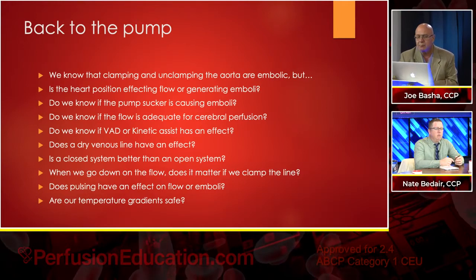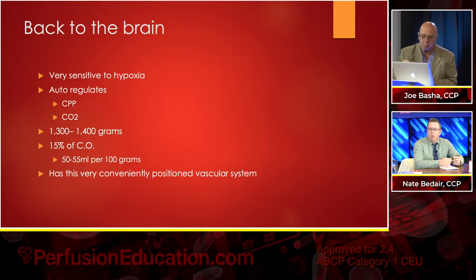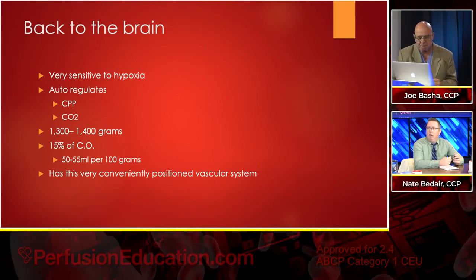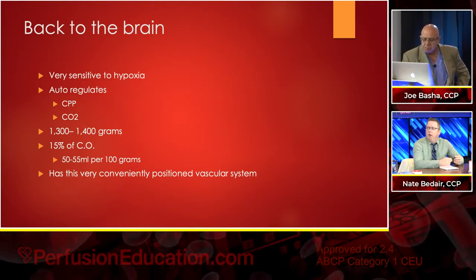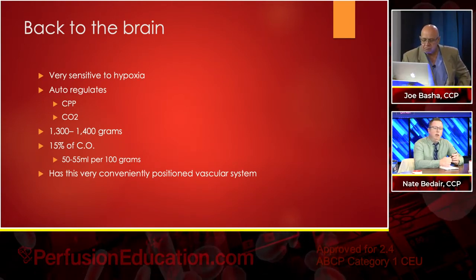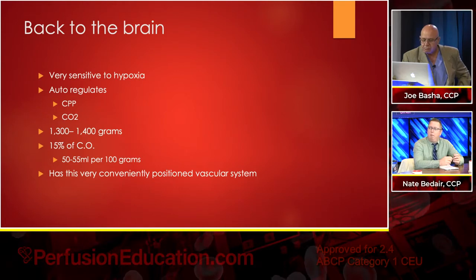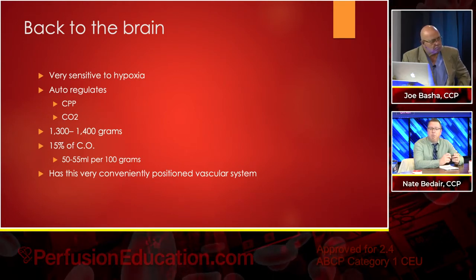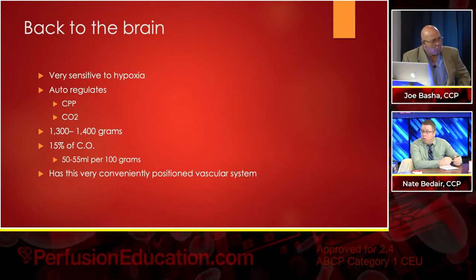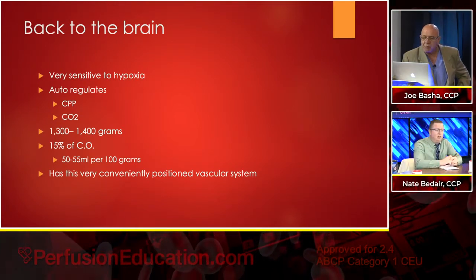That's a big one. I don't know about stroke-wise, but I've had that thought before, because a lot of times our surgeons will drift and then they say rewarm. Well, it's a big patient, a 115 kilo patient, and I know that he's got 2 proximals. To rewarm, I've got to scramble. I've got to be cranked wide open, and we're starting at 30 degrees. And these rooms are cold, in some cases really cold, so it takes quite a bit to rewarm that patient. So I've got my water temp cranked. Otherwise, at the end, they're sitting there waiting on me, looking at me going, did you start rewarming when I said? But I asked you 10 minutes before that for a reason. Anyways, sorry, we probably shouldn't do that.